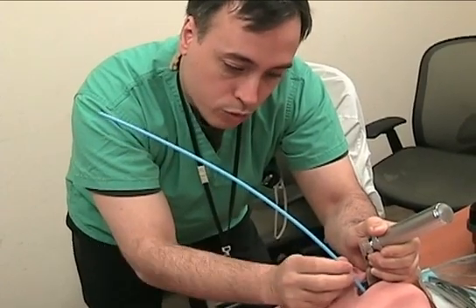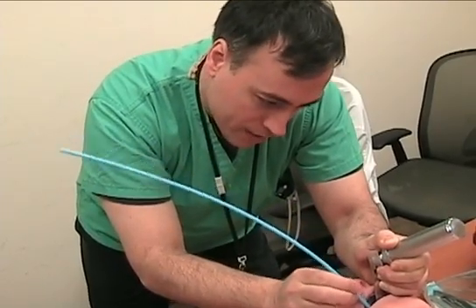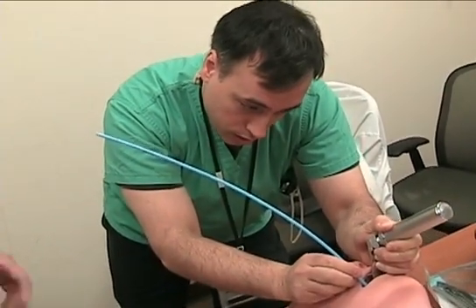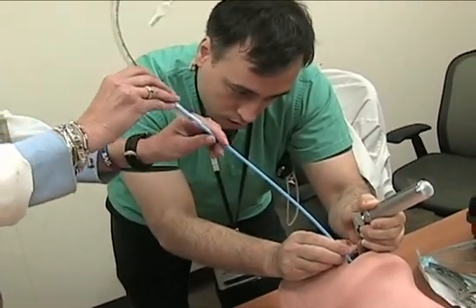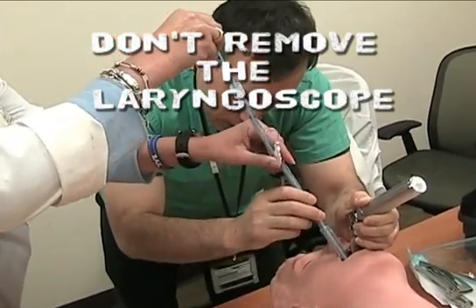Once you've confirmed by holdup — that point of the bougie stopping — you just withdraw until you're at about 25 centimeters, and then you'll put the tube onto the bougie. Now, for this, you really want a partner. It's really tough to do yourself, because one of the key mistakes made is taking the laryngoscope out of the mouth. You want to leave the laryngoscope in to keep those posterior pharyngeal structures from collapsing on your bougie.